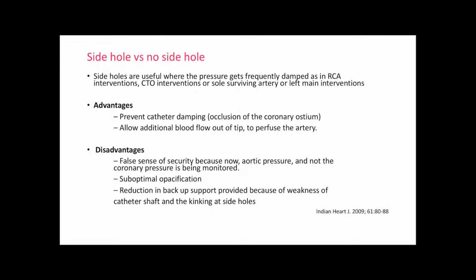For example, a pigtail has a central hole and side holes. That's because the pigtail has a purpose to measure pressures and to give contrast injections, so that's the whole purpose for that. It really makes sense to have multiple holes so that you have more contrast visualization.